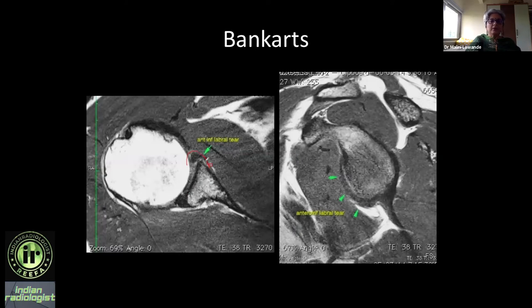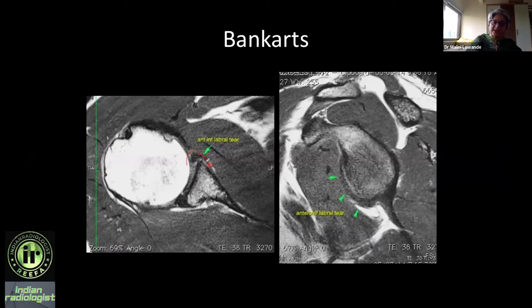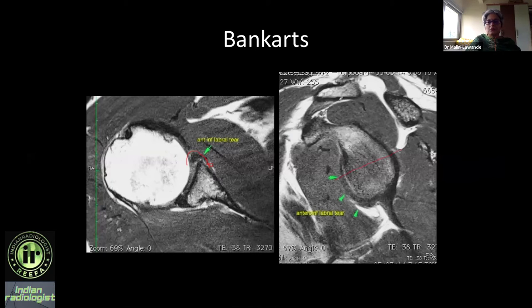In another case you can see a labral tear with the periosteum a bit intact — if intact you can call it a Perthes lesion, but if you don't use these different fancy names, that's fine. Just describe the extent of the tear. We talk in terms of quadrants.